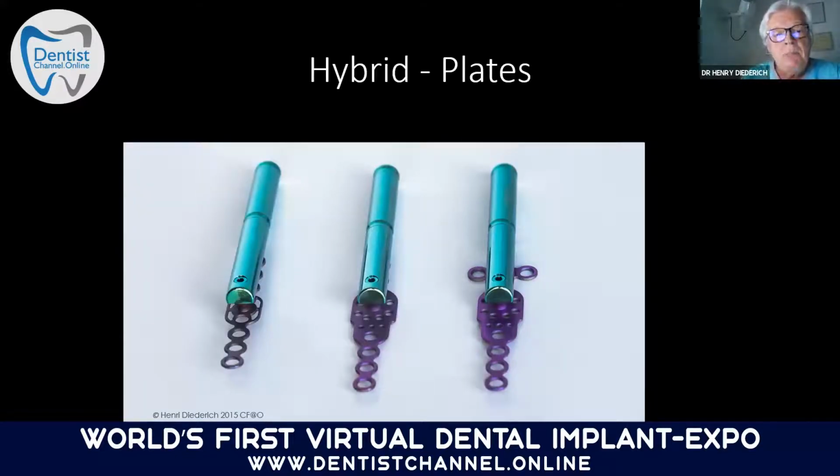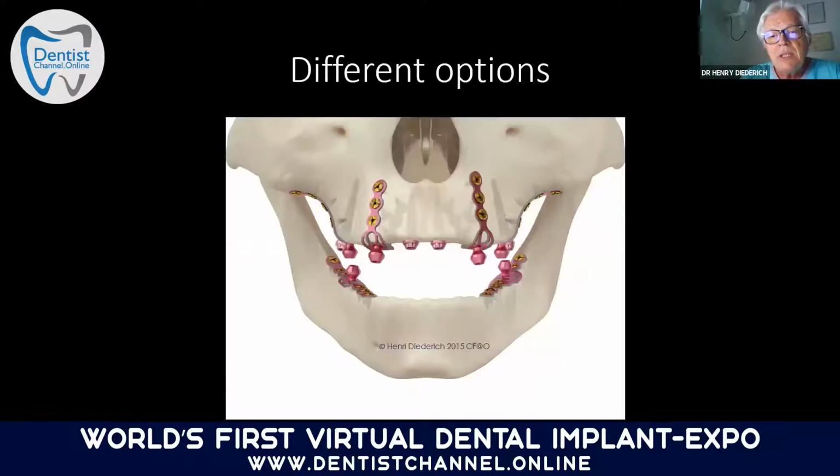Let's come back to our plates. You see here is a presentation of the plates. And then we have different options, and the options, another time, depend on our bone situation. We have a lot of bone or not much bone, and the decision is always taken regarding the presence of bone.